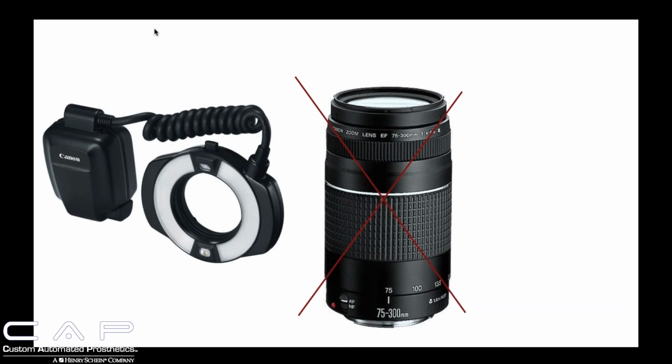It does work with a lot of other things. A lot of people use it just for posterior mirror shots. And that's fine too, but with the macro flash, the twin flash that I showed you, you can set that up to where you're going to get a pretty similar effect that you would with a ring flash. So it's not really necessary.